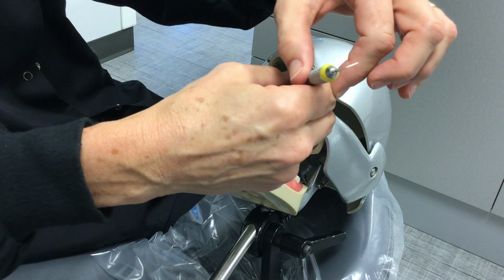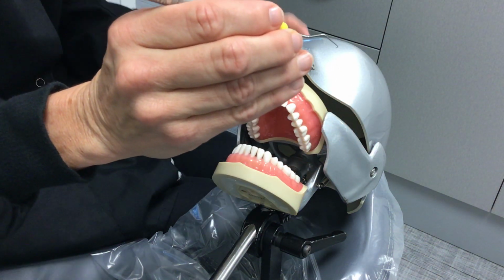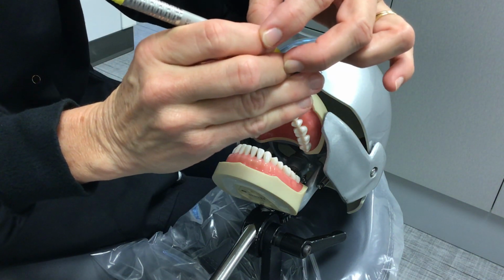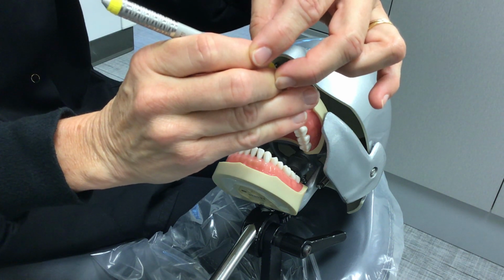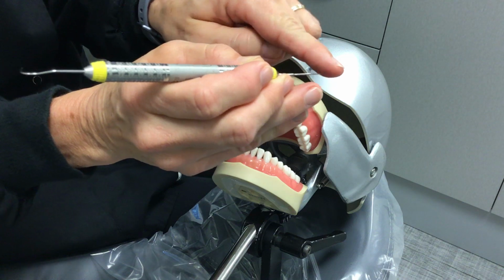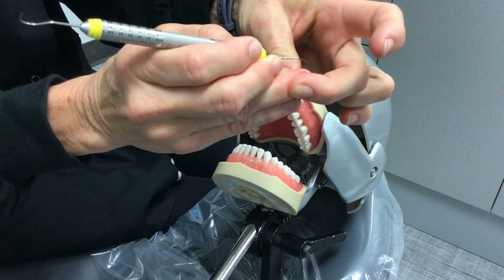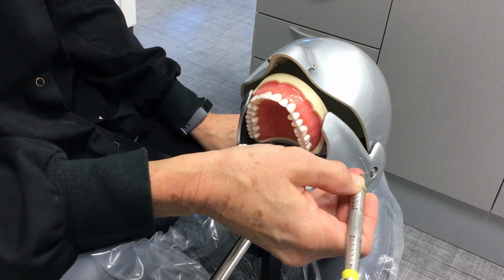The next thing that you're going to do is take your fulcrum finger and extend it ahead of the other fingers in your grasp. We practice this in class, and you've seen it on your clinic key video. This is very important because you have all this extra length in this particular explorer, so you need to extend that fulcrum finger.